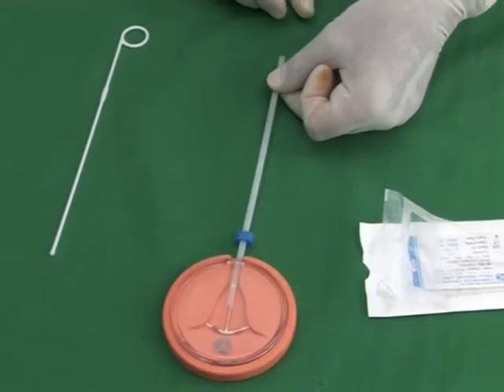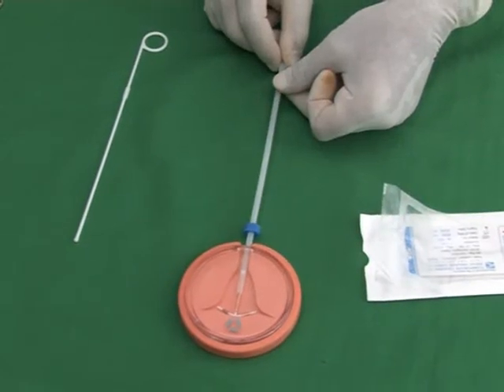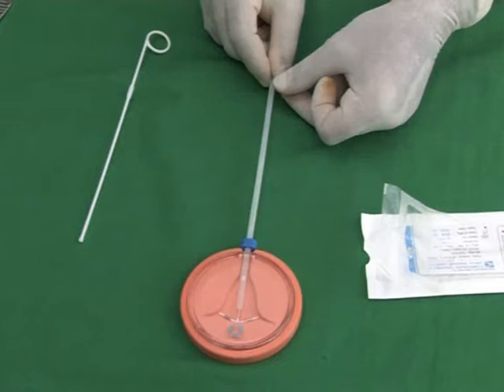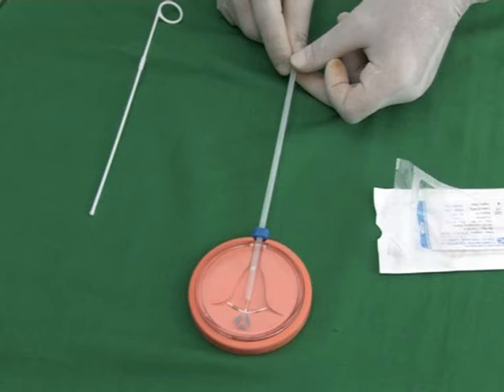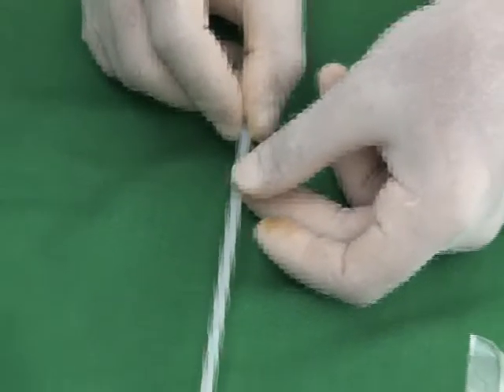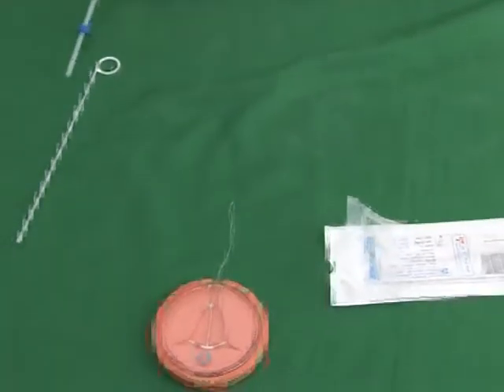Once you have done this, make sure that you again move the outer tube towards the uterine fundus so that it will help to position the intrauterine device properly in the uterine cavity. Then you withdraw the outer tube completely from the uterine cavity and the cervical canal.